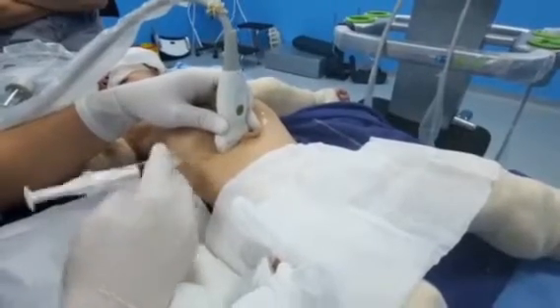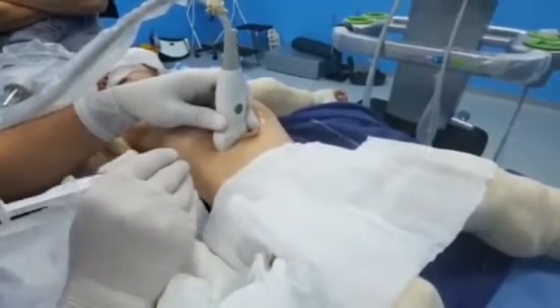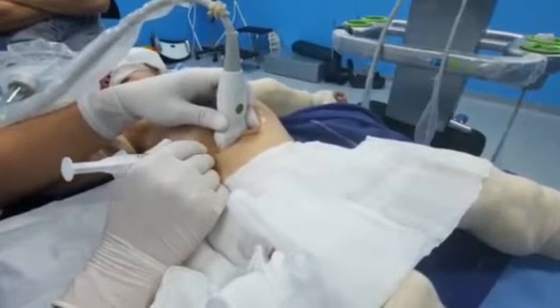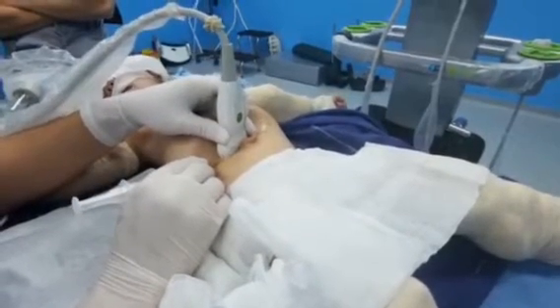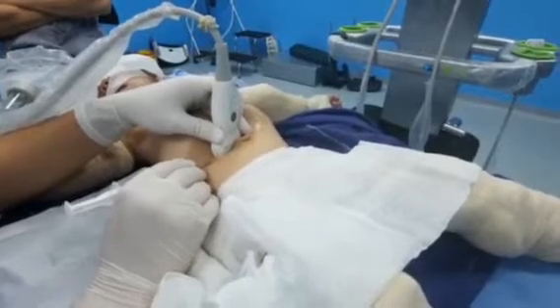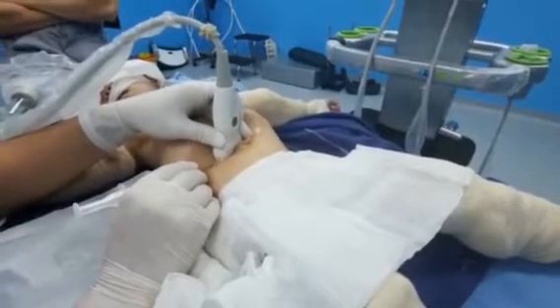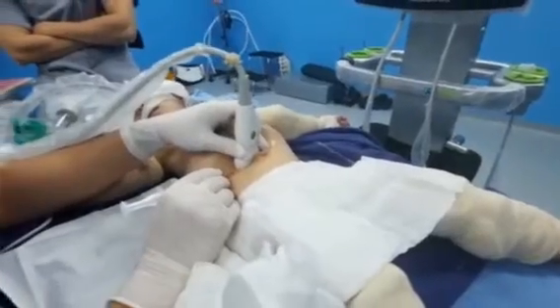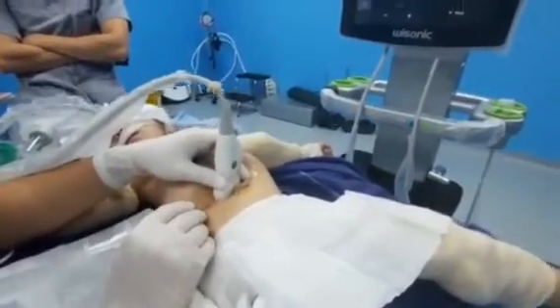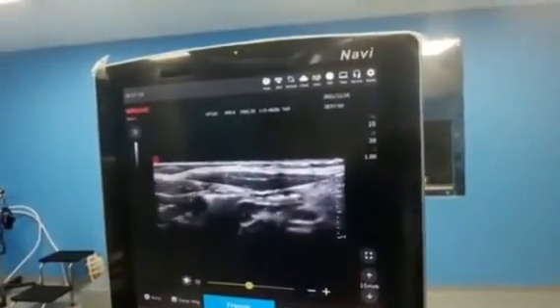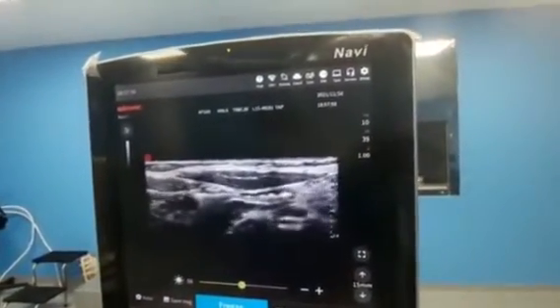The technique is an in-plane technique. We use an in-plane technique, and we go to the posterior aspect of the muscle. You can see this in-plane technique on the screen.